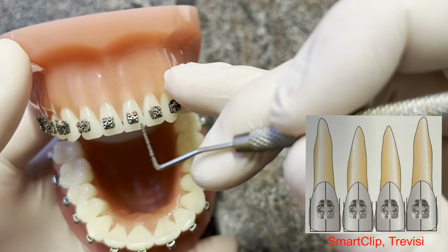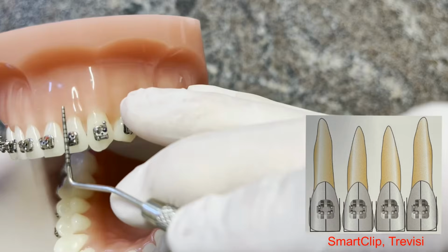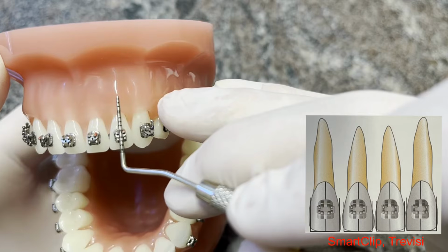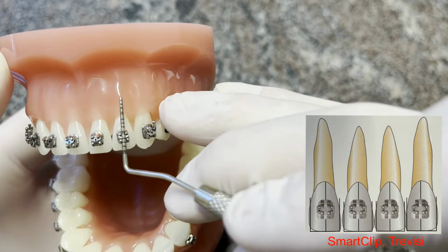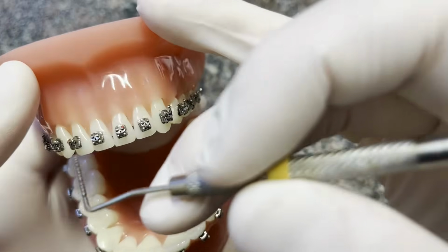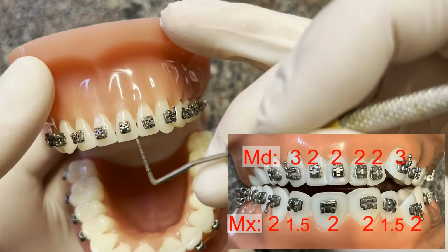This one's looking pretty good. This one is terrible as well. The long axis of this tooth is kind of here-ish, and you'll see how that one again is 5 or 10 degrees off. So you would set this bracket more like that, whereas right now it's kind of like this. And then same thing, oh, and these are maybe roughly 2 millimeters from the edge of the tooth.